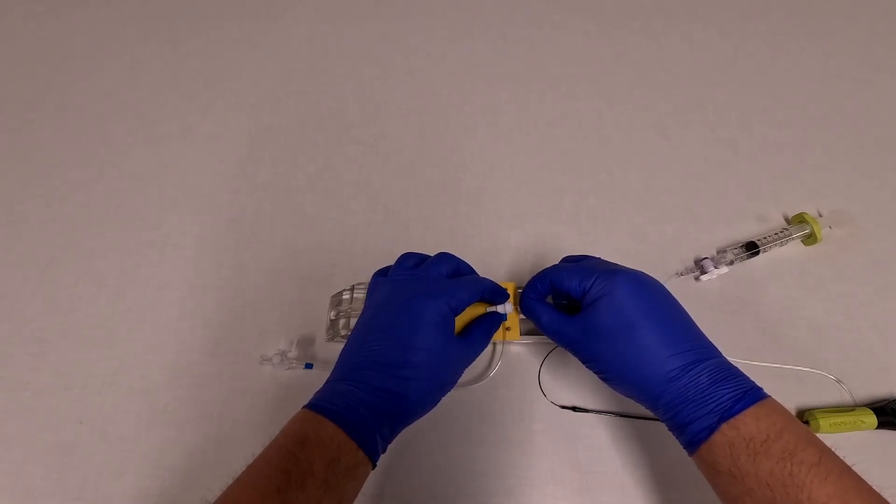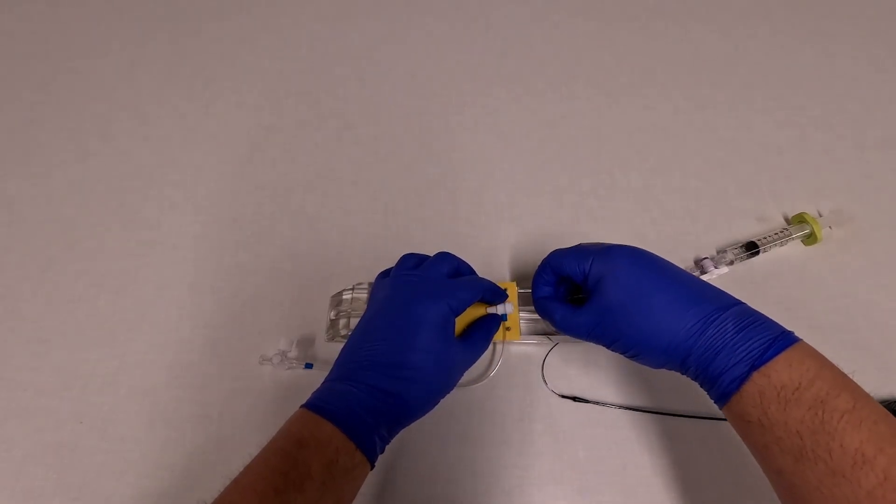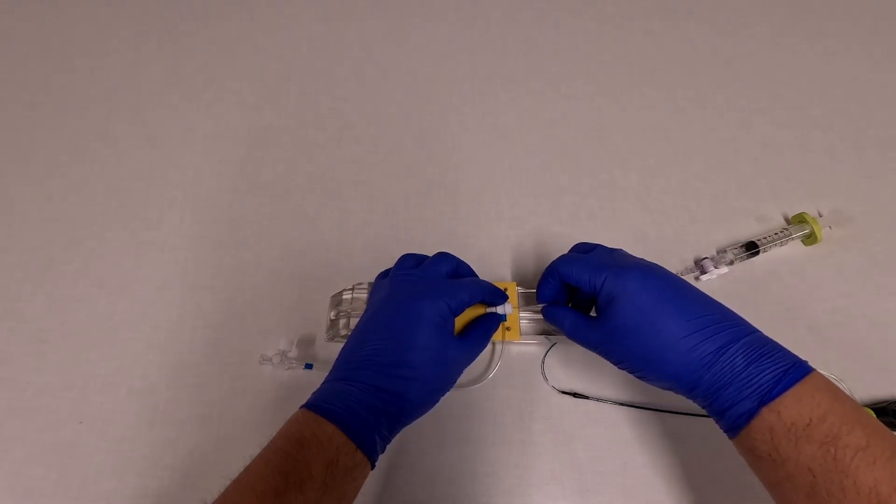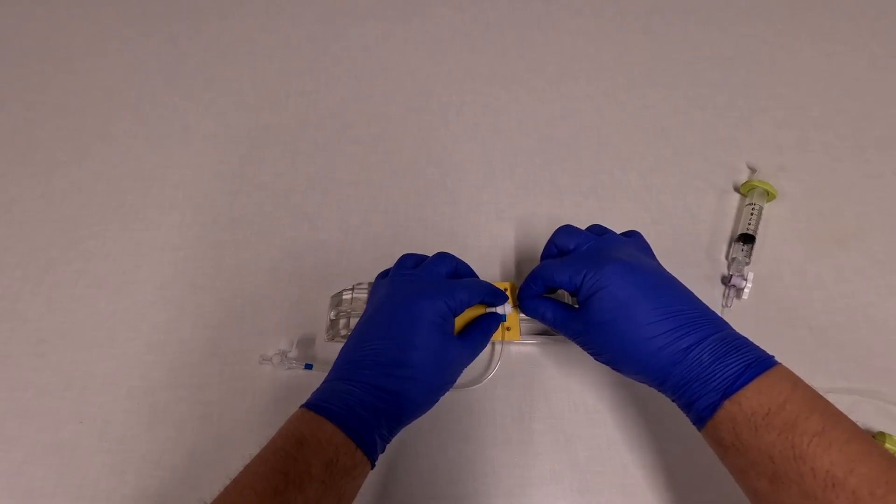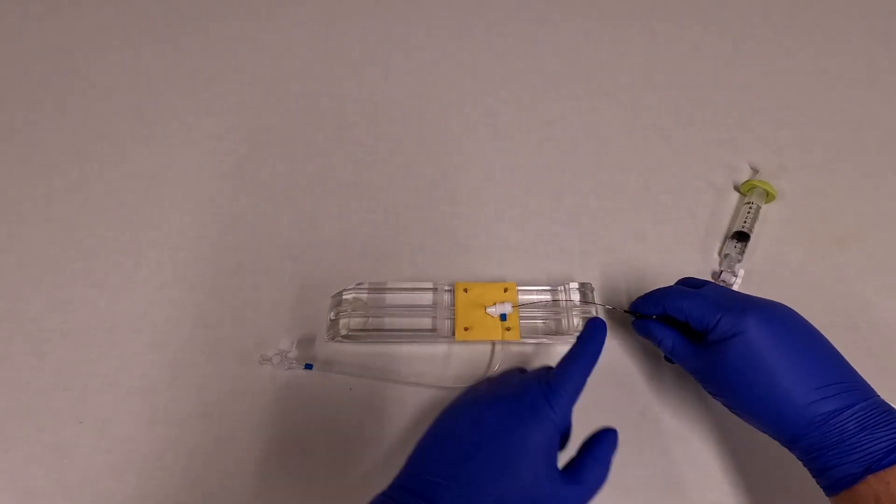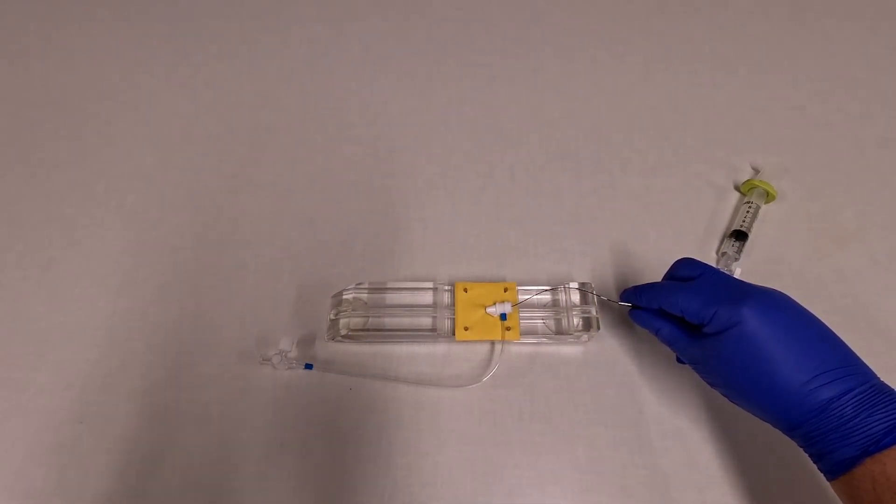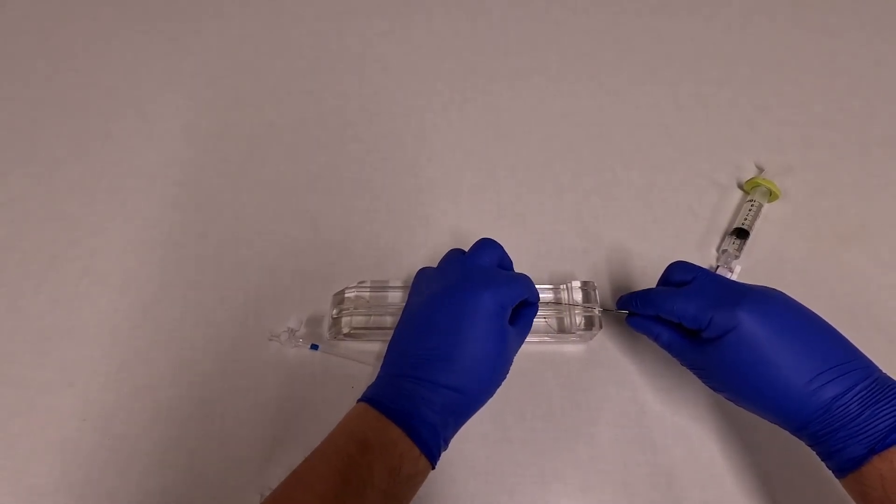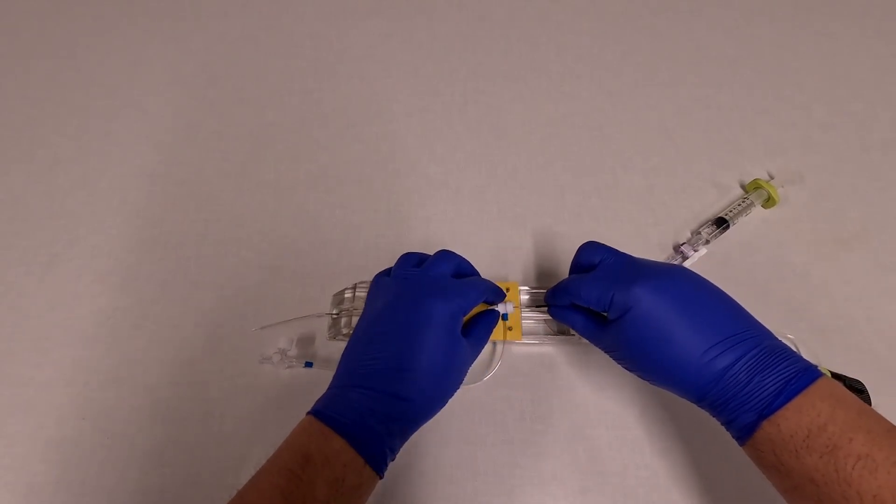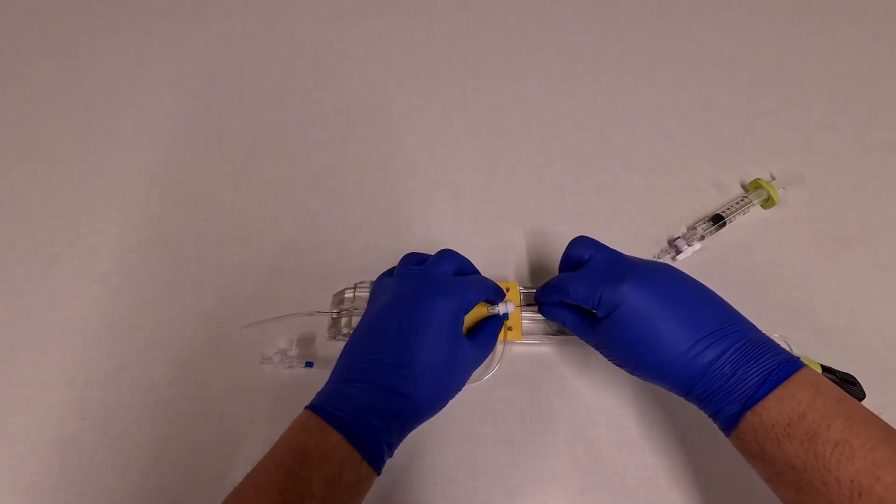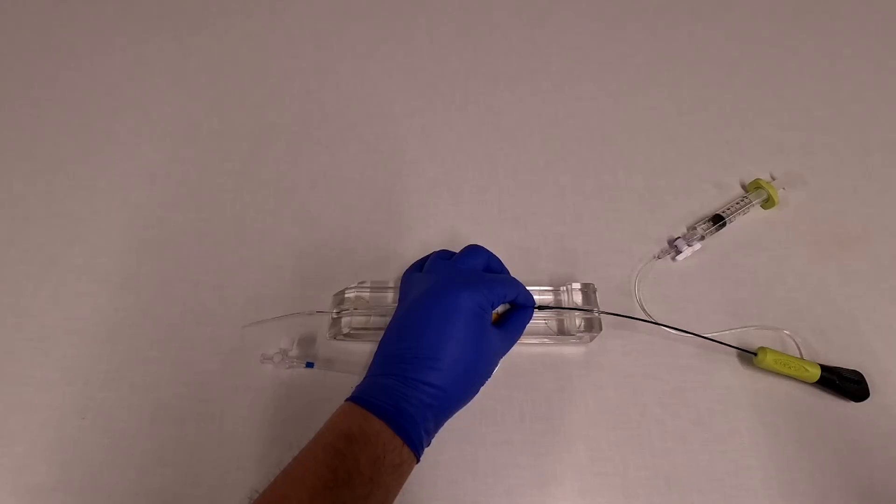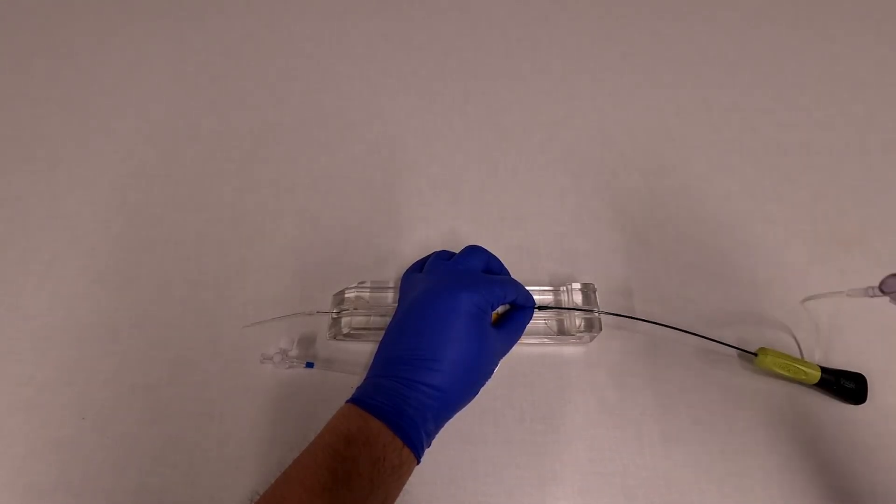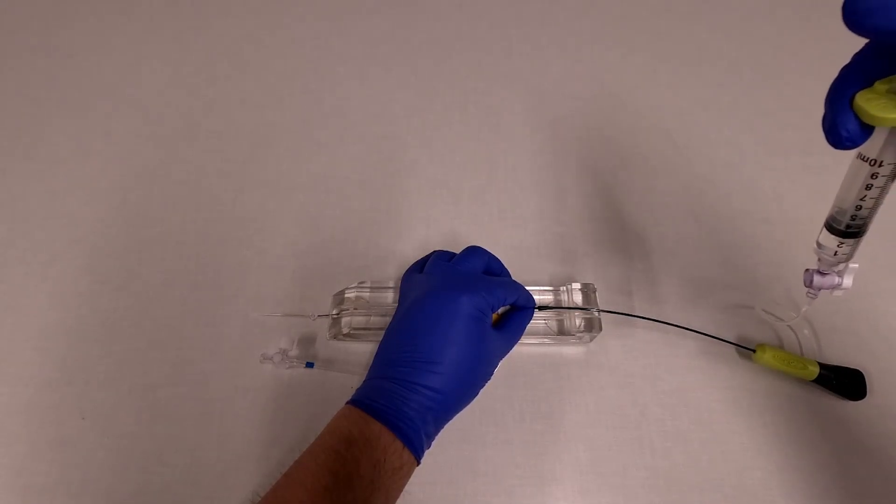Now we're going to take the device and insert it into the sheath. Hold it close to the tip so that you can push it into the sheath. And then keep inserting until you reach the white marker. You can see the white marker here. And you're going to insert it until the white marker reaches the hub of the sheath. This means that the balloon is in the vessel.